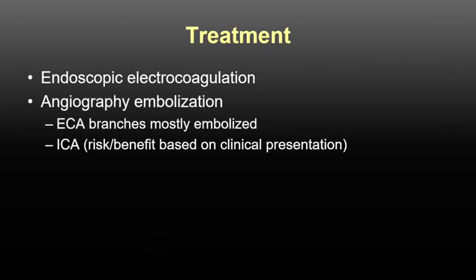Here are the treatment options. Note that the external carotid artery branches are more liberally embolized compared to the internal carotid artery, given there is more robust collateral circulation within the face.